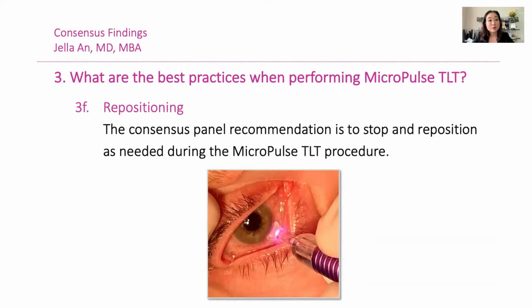It is acceptable to stop and restart during the treatment cycle if it's necessary to reposition the probe, because we felt that the proper positioning of the probe is much more important than possibly losing the heat because of stopping the technique. You want to make sure the edge of the probe, the bunny ear, is always at or slightly behind the limbus at all times, and the posterior part firmly pressed down to the sclera.